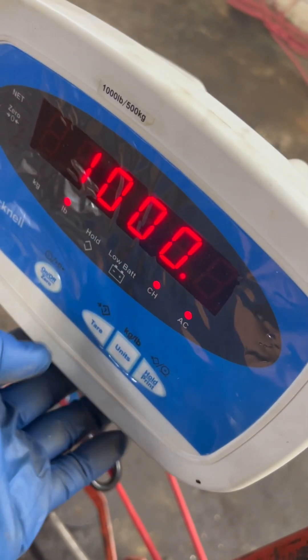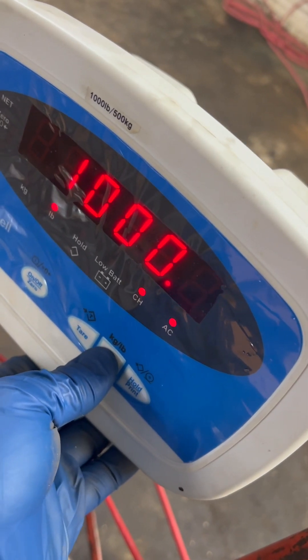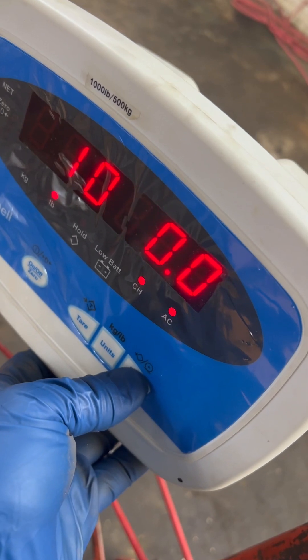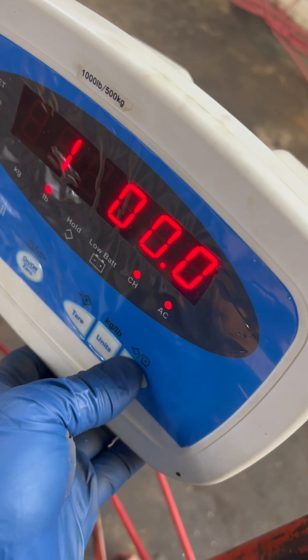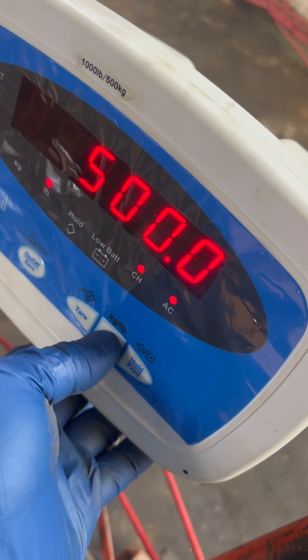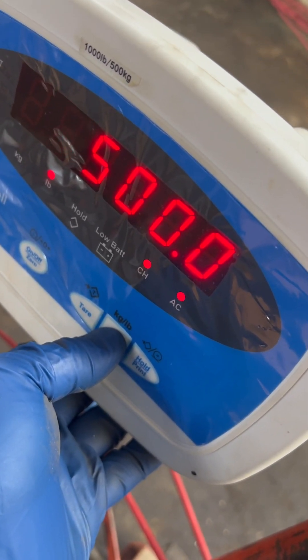It's cal point two. I'm going to change to 500 because I have 500 on there. You could also break that in half to 0.1, 250, 0.2, 500.